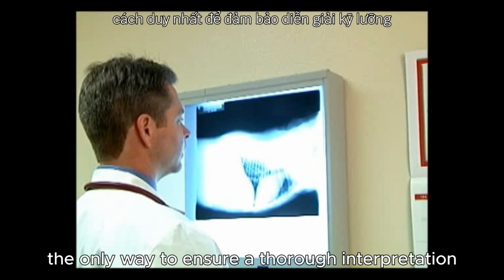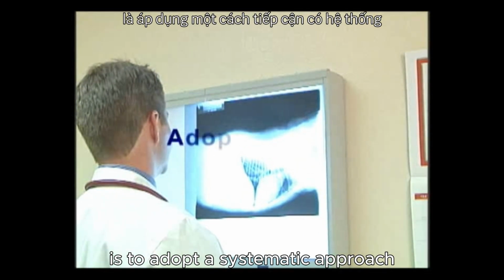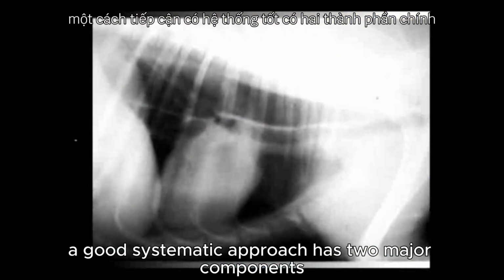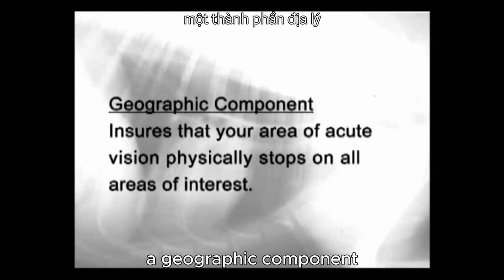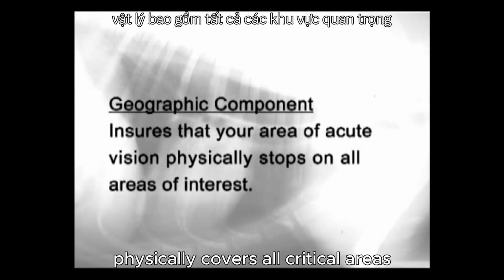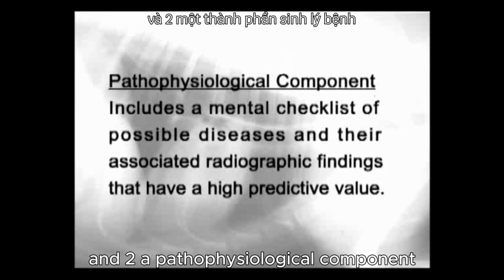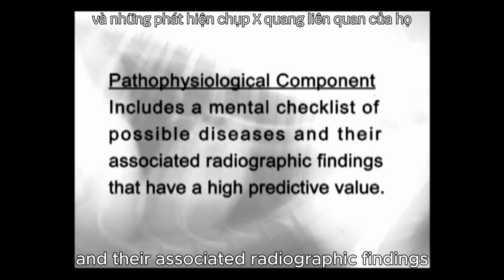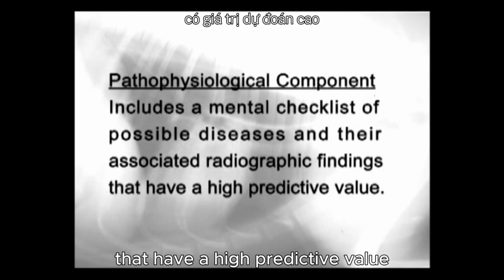The only way to ensure a thorough interpretation is to adopt a systematic approach. A good systematic approach has two major components: one, a geographic component that ensures that your area of acute vision physically covers all critical areas, and two, a pathophysiological component that includes a mental checklist of possible diseases and their associated radiographic findings that have a high predictive value.